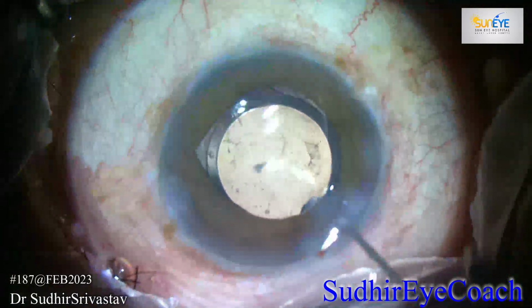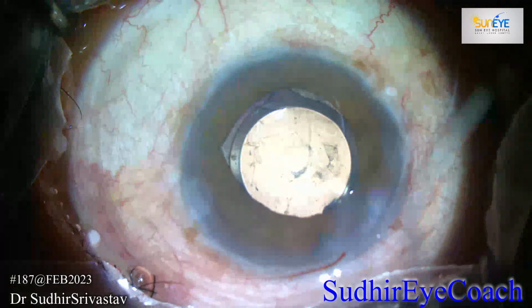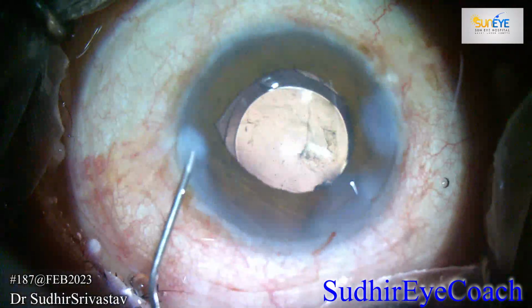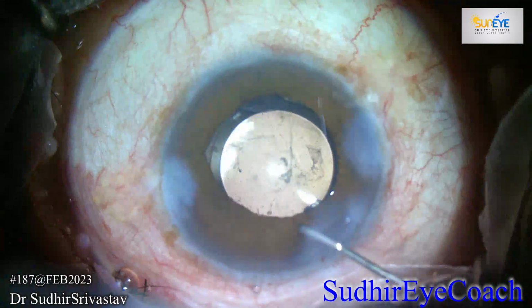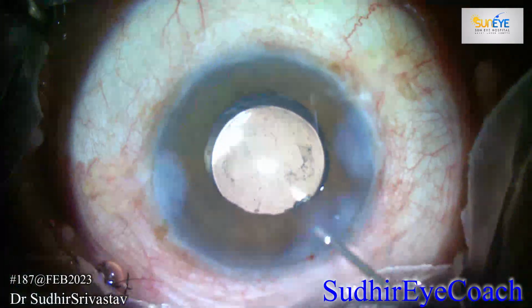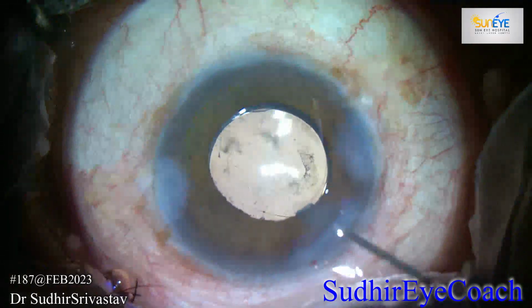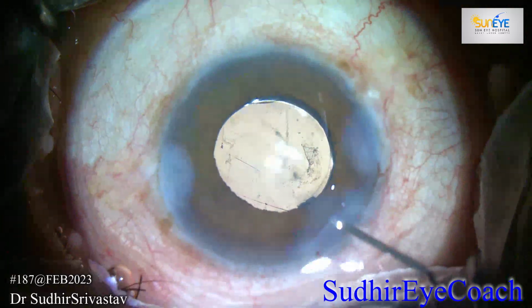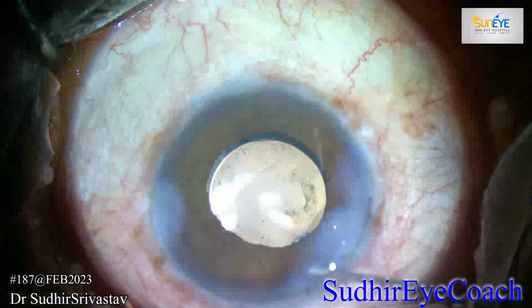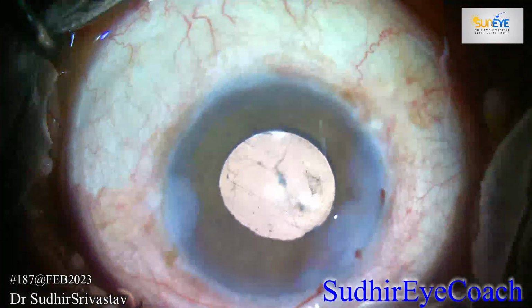I irrigated the chamber with miotics so that I could see the shape of the pupil, because that is the first clue to get an idea about vitreous strands present in the anterior chamber or reaching the incisional area. Fortunately, there was no vitreous present in the anterior chamber. There was no need for vitrectomy.